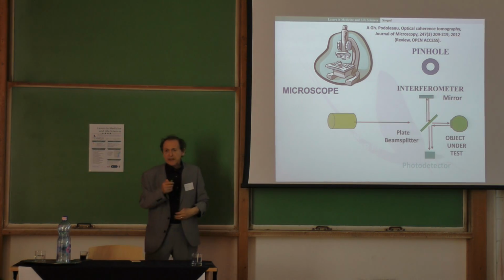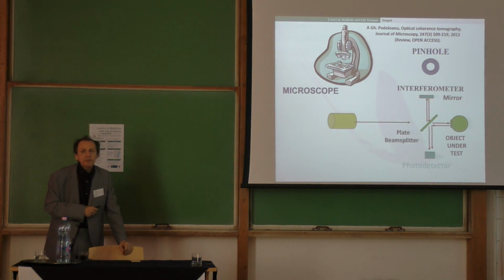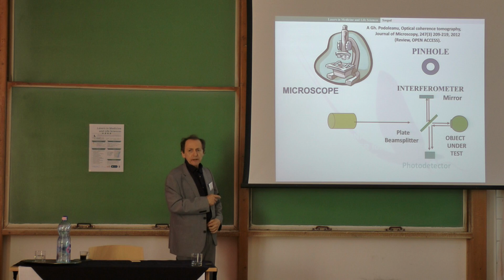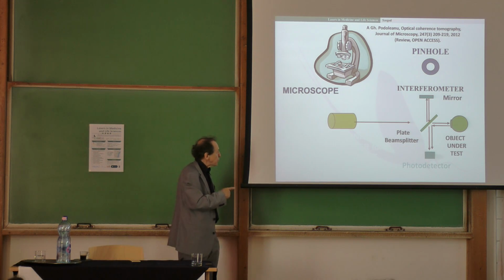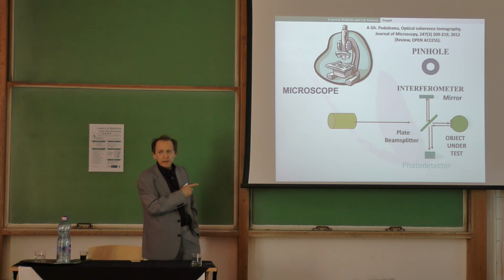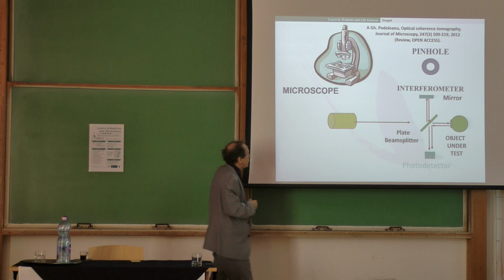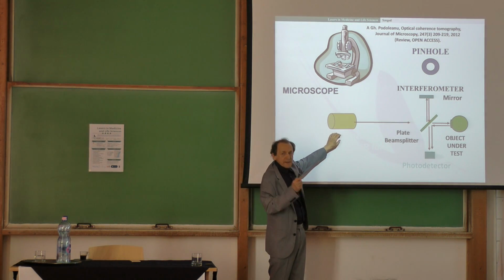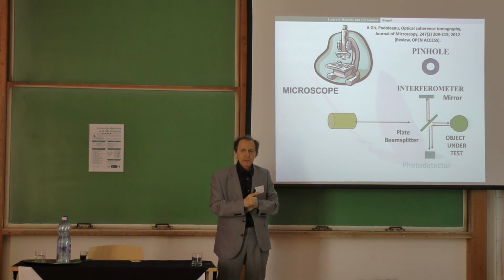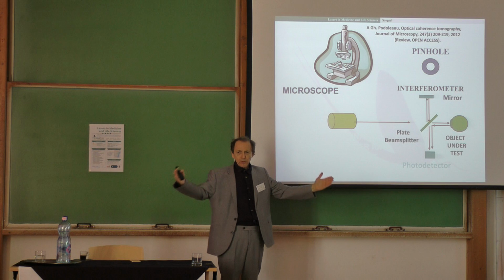Now, the second type, which is practically the most used type, now look at the difference. That's the only difference, not much. That's the only thing you have to change, and you obtain the modern technology, which not every commercial system in the world now uses, but the tendency is that for the next, let's say, 5 years, we will see more and more of this principle. So instead of a broadband source, you use a laser. Now the laser will be practically monochromatic, a well-defined emission, but you tune it. And to achieve the axial resolution again, you have to go into those boundaries.